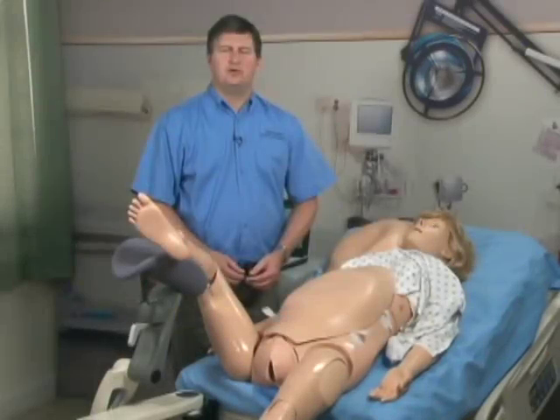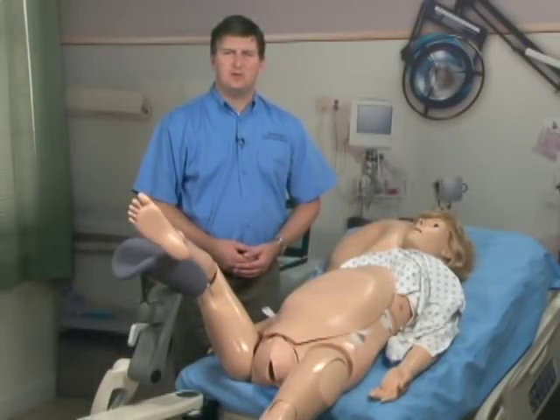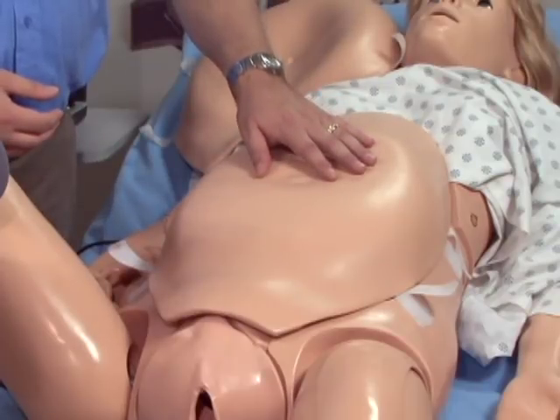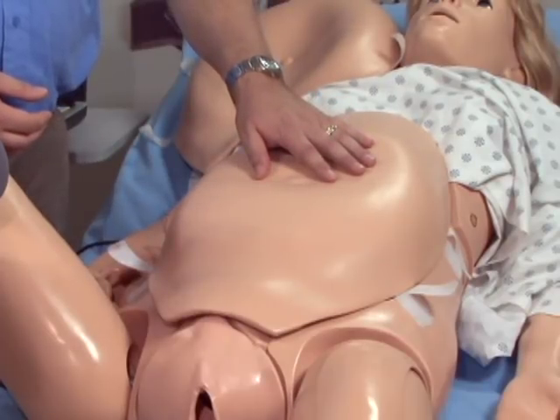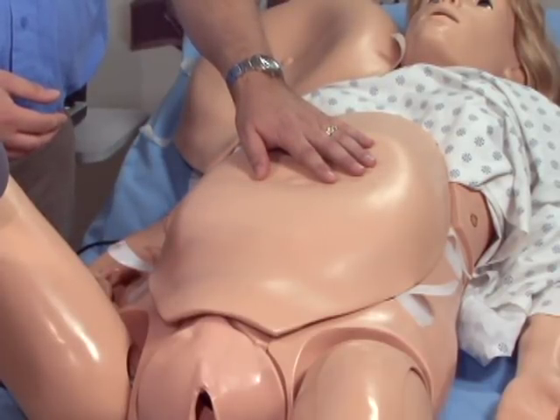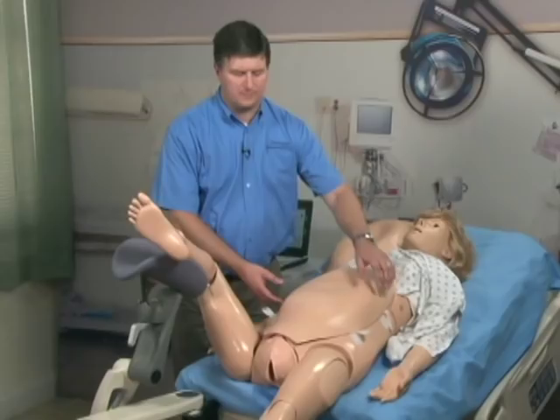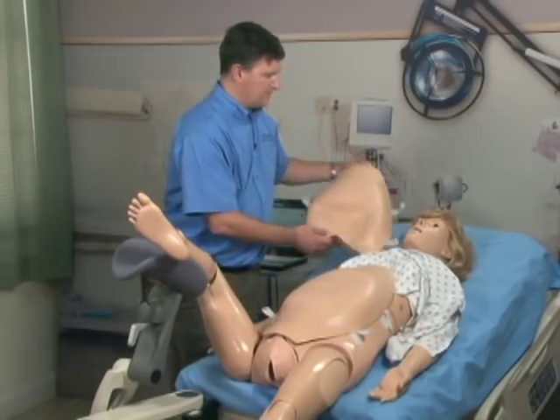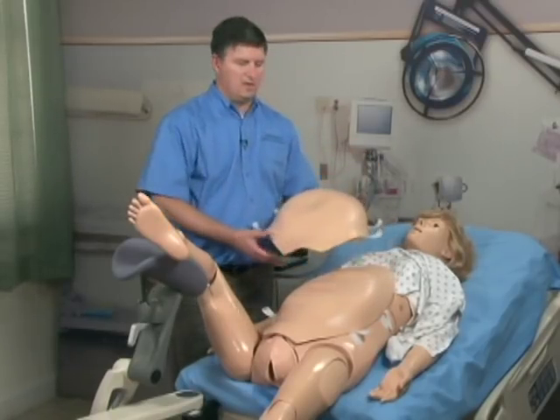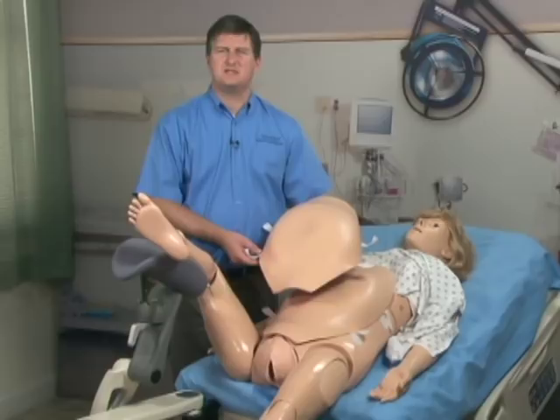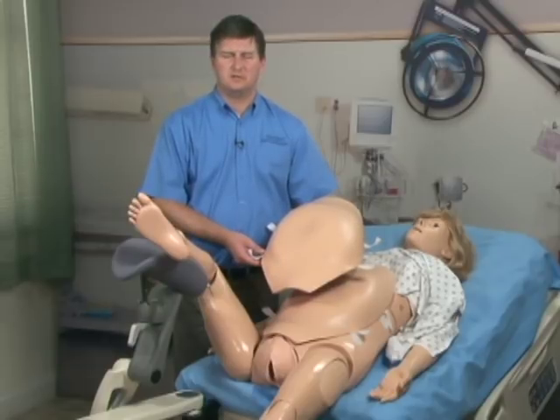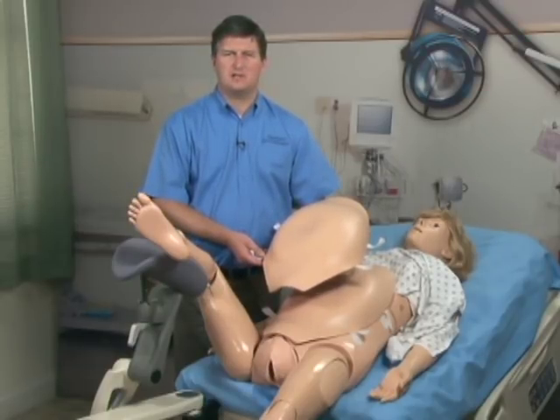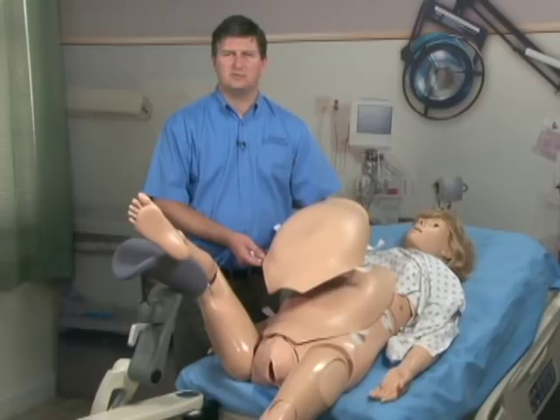Your NOEL simulator comes with two abdominal covers. The first of which, the contracting cover, we used already during the labor scenario. The second cover is the C section cover, and we use this for postpartum hemorrhage and Leopold maneuvers.